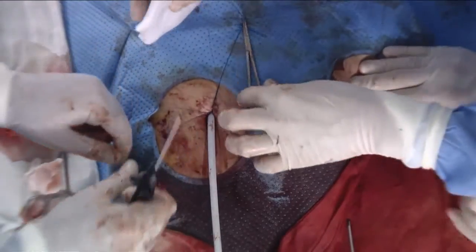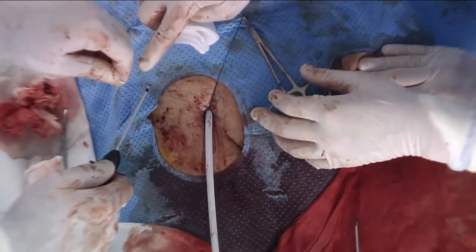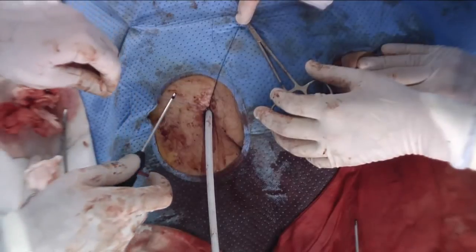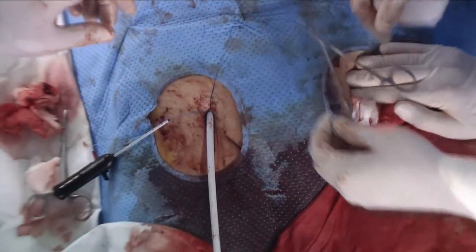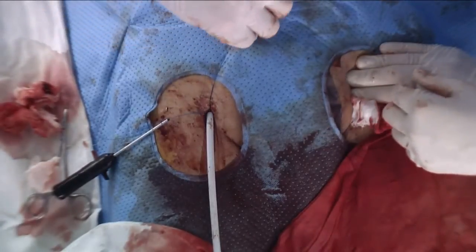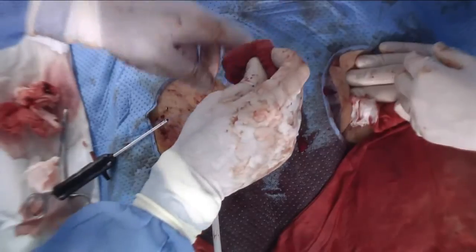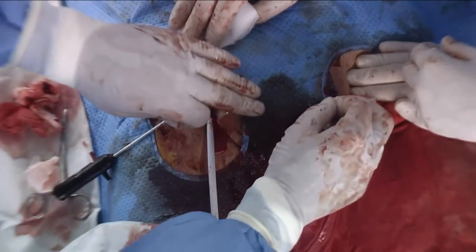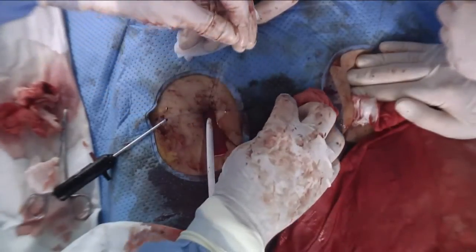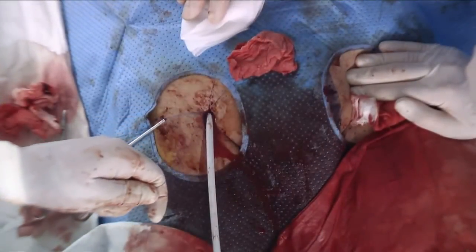It's a great case. You knew there would be an issue on the left side and dealt with it accordingly. Okay. And so it's always important when you're doing the pre-close to keep track of which device you deployed first. In this case, the medial device was the first one deployed, and the lateral one was the second one.